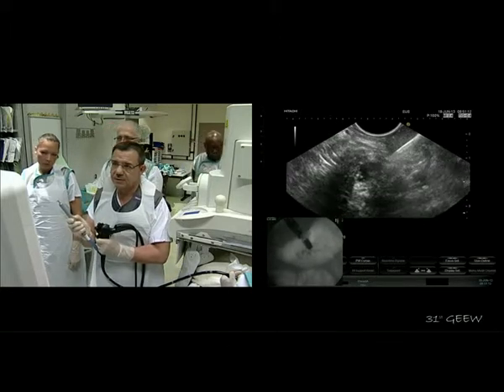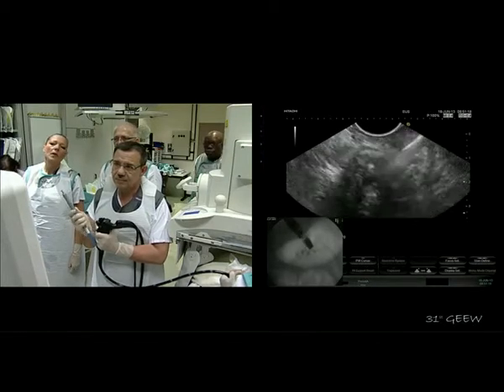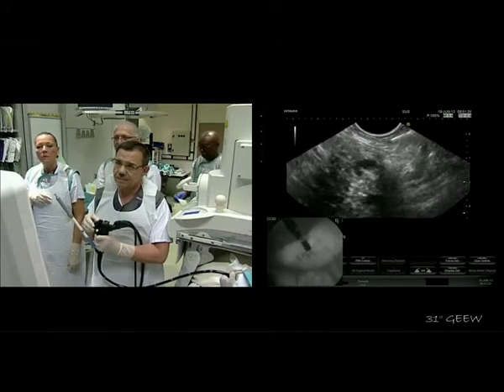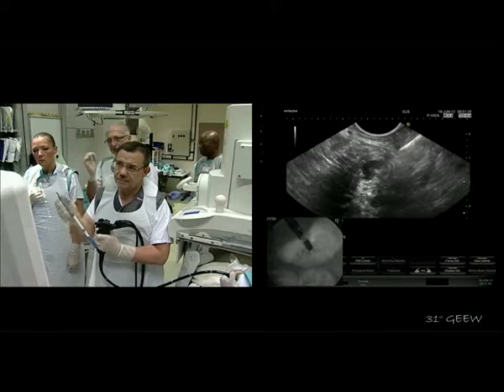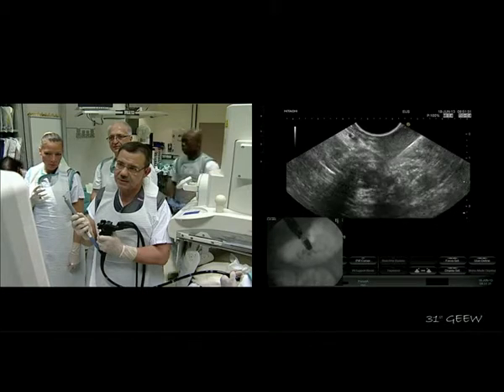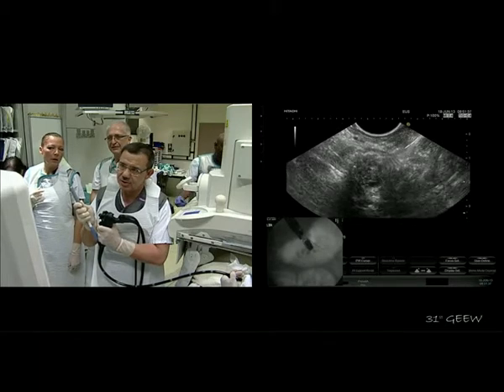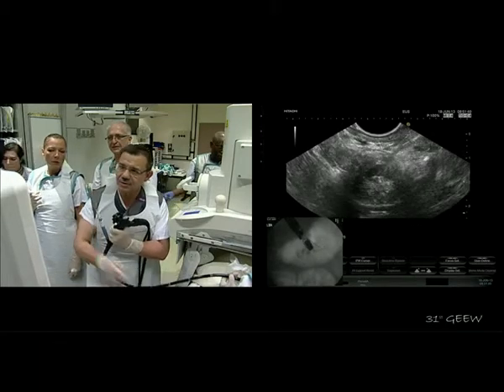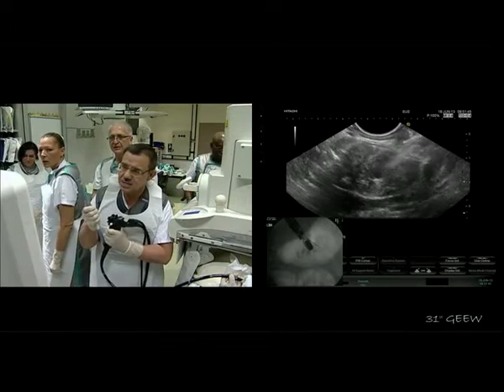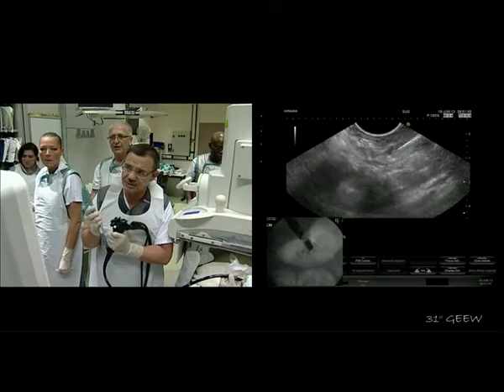I personally use very often the needle of the cystotome, or even I put some cutting current on the 19 gauge needle in order to enter more easily inside. You want some current on your needle? But I don't know the direction of my needle. I try to be as close as possible to the wall, like this.